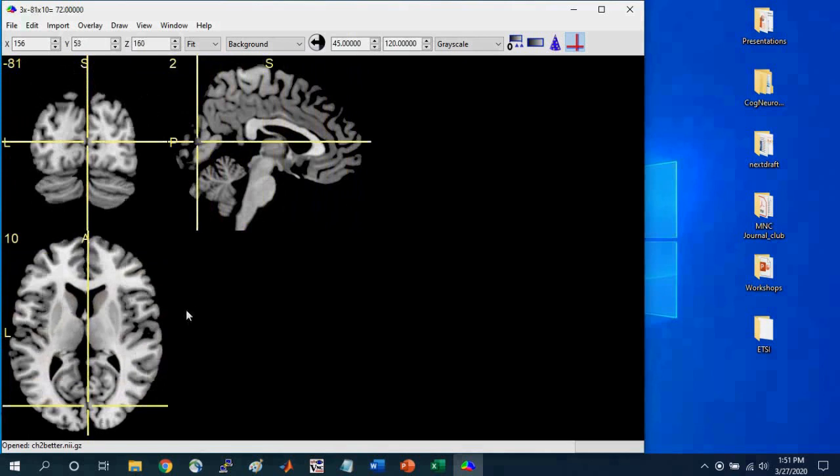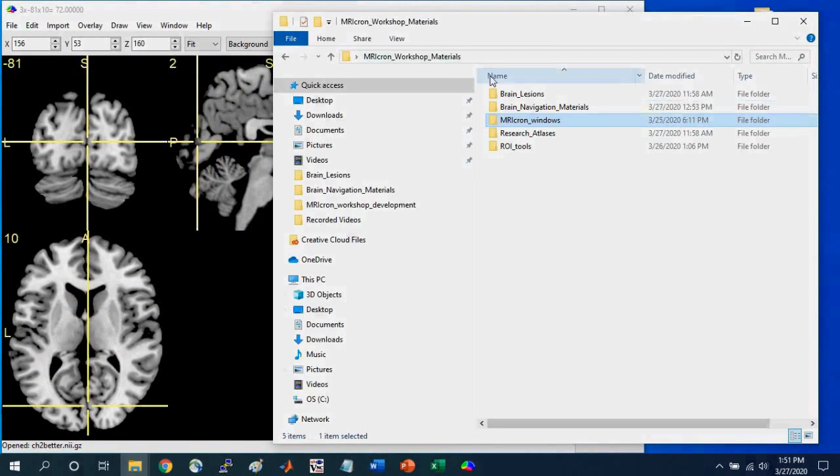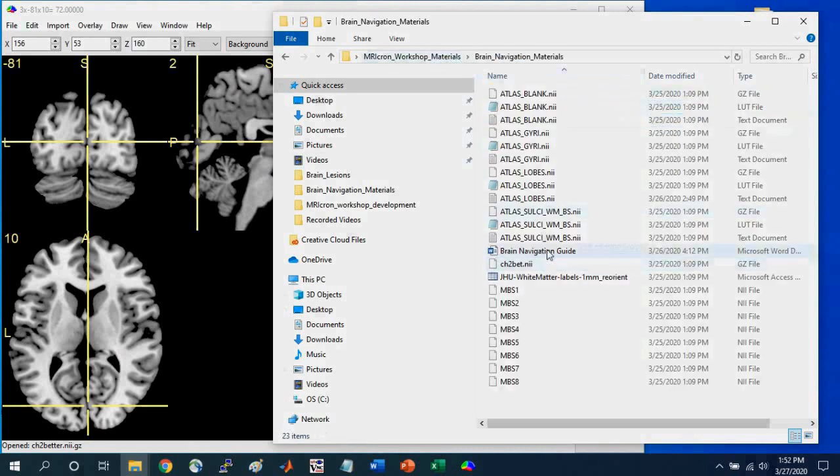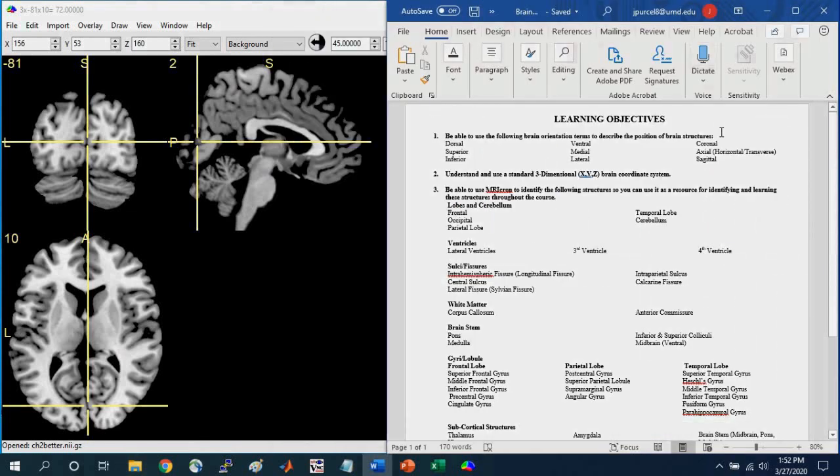And before I go any further, I want to point out in the MRIcon workshop materials folder, so within the brain navigation materials, there is a brain navigation guide, which has key terms that are important to note. And so I've already gone over all the terms here.